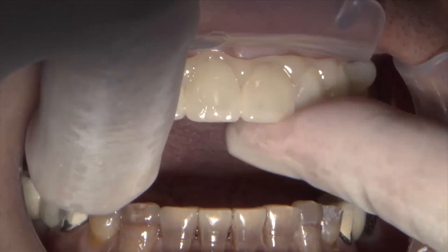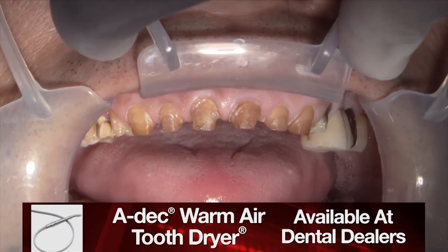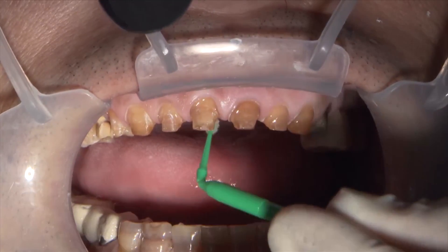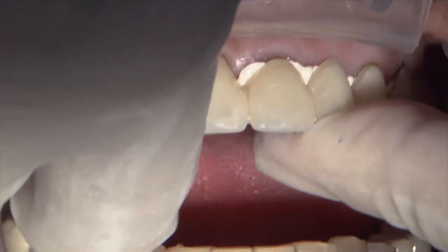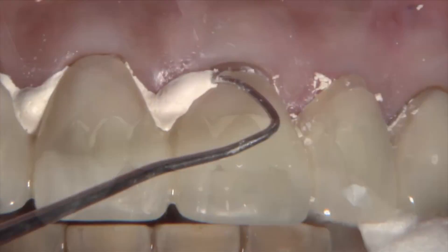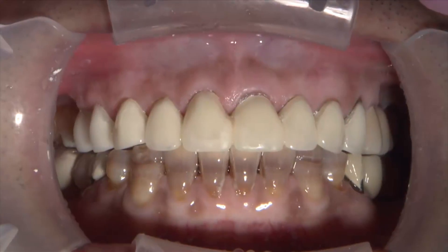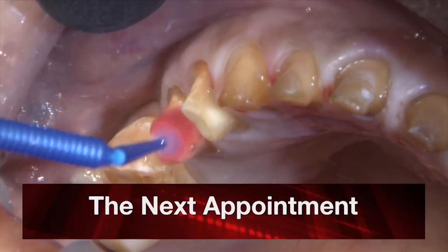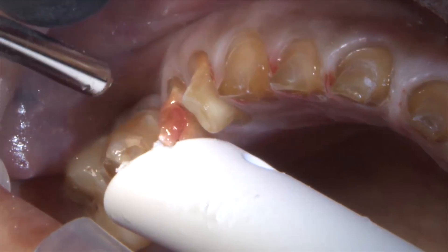I'm relining it with bisacryl here. You can't really pump it up and down like you would in the old days with methyl methacrylate, but we want to make sure we don't lock it on, so sometimes as it starts to set I will wiggle it and then put it back in again. Here's the G5 desensitizer being used. Rella Christiansen has shown that two one-minute applications of this kills 99.9% of the bacteria. We used to just do it at the crown cementation appointment, and one day I asked Rella why aren't we doing this at the end of the prep appointment before we put on the temporaries — because we know they're going to leak like a sieve.